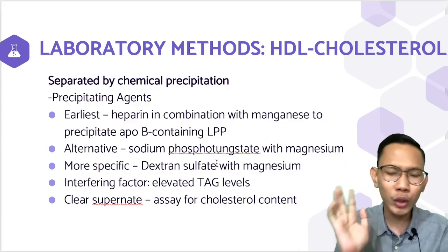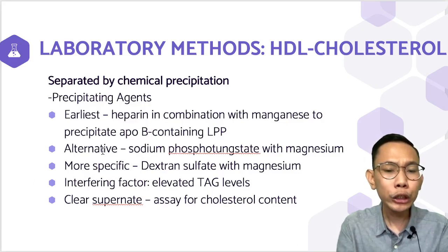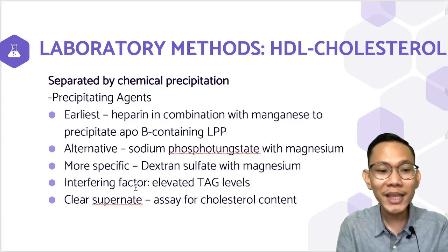So later on guys, don't you worry, makikita natin yan sa components ng ating reagents sa ating package insert. I will explain that clearly later on. However, there are interfering factors, your elevated triglyceride levels. And then, the clear supernate is assayed for your cholesterol content. So, pwede magagamit yung clear supernate for assay for your cholesterol content.